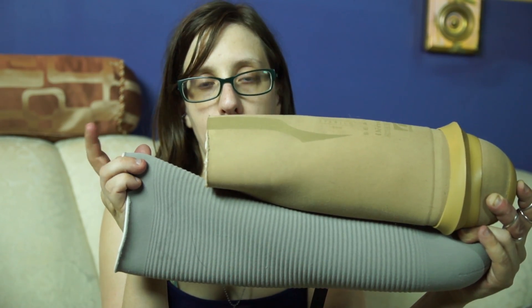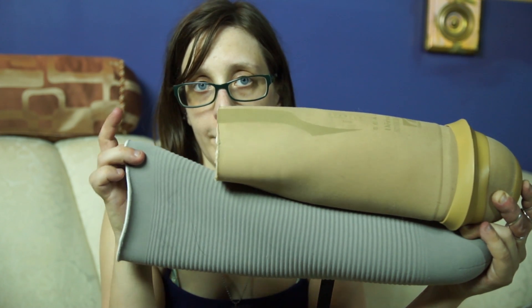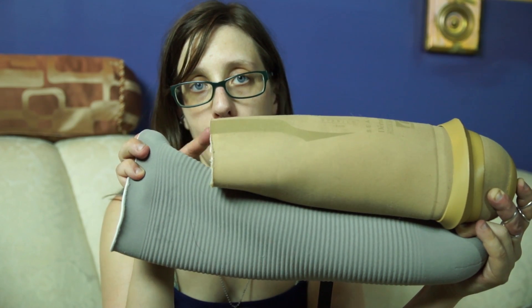Usually liners come in one length, but you can trim the liners if you so desire to whatever length you like. So this liner, this gray one, is full length, and this one has been trimmed.